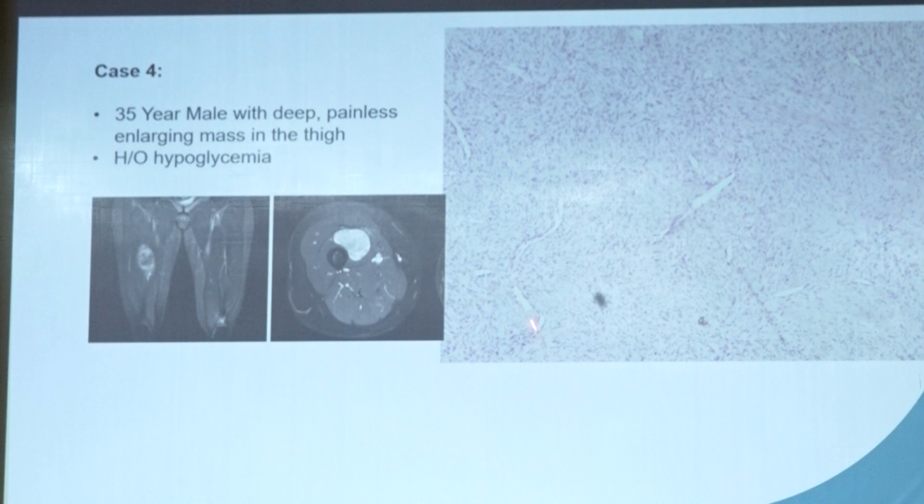What do we call this? This is the same hemangiopericytomatous vessel or hemangiopericytic vessel. We are no more calling any tumor hemangiopericytoma, with only one exception. Please do not diagnose hemangiopericytoma now. There is only the meninges which has still retained this tumor. If you have to diagnose hemangiopericytoma, only diagnose it in the meninges or the brain. Everywhere else, it is only a pattern and probably denoting some other tumor.